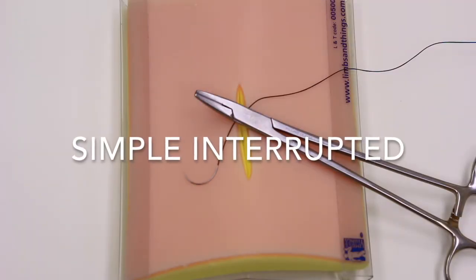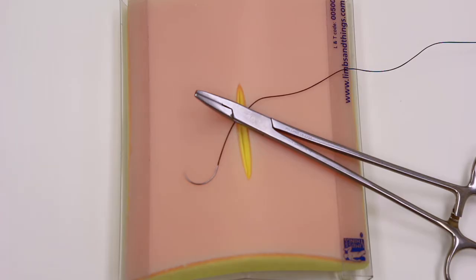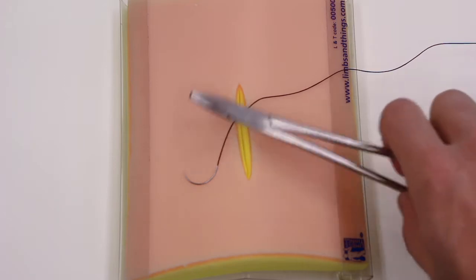I'm going to start by talking about the simple interrupted. This is most commonly used to close lacerations, but only a technique used to close the skin.